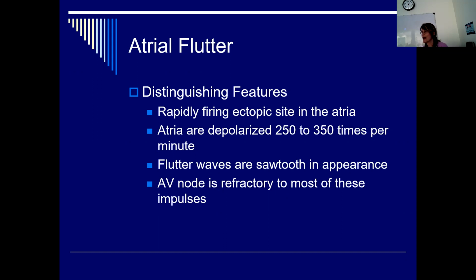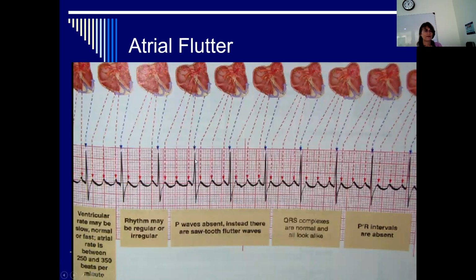Do the ventricles respond 250 to 300 times a minute? No, they don't. So let's see what it looks like. All right, if you're just looking at all of these little upward deflections, does it look like a bread knife or a saw? Serrated, yes, serrated edge.